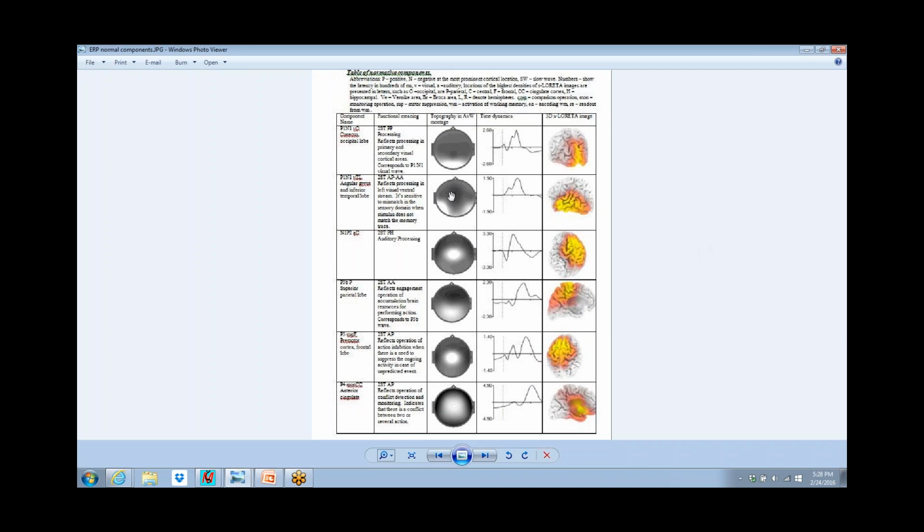you can see this, for instance, has a left side emphasis. This is the normative distribution in the European database. The South Koreans have a bilateral balance between their processing. It's a different style. It's not normal, abnormal. The latency is not different.